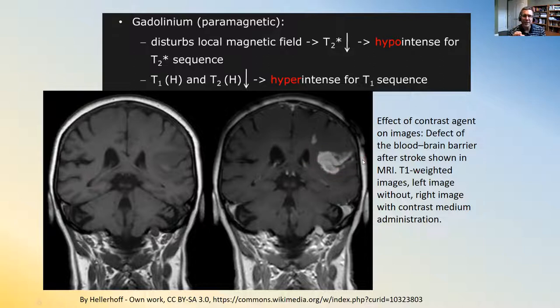Now the doctor knows immediately where that bleed is inside your brain, and they can go in and take some action. X-rays won't see this at all. Normal MRIs, not so much. Beautiful image due to the pushing of that contrast agent.